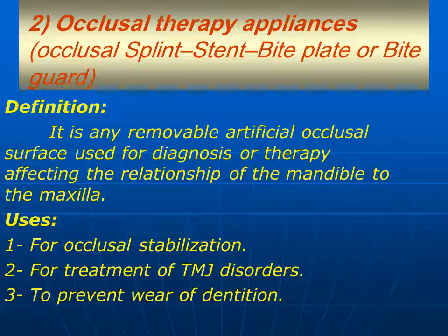It's used for occlusal stabilization, that's to say, correcting the relation of occlusion. It's used also for treatment of temporomandibular joint disorders. In addition, we can use it to prevent wear of dentition in patients with bruxism.